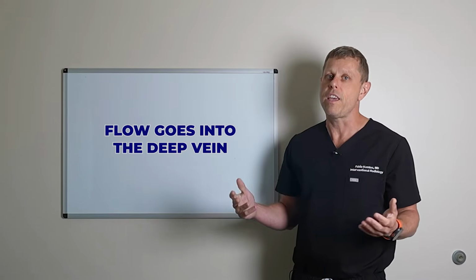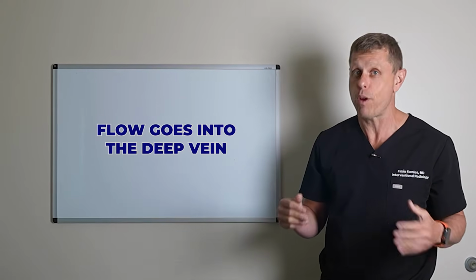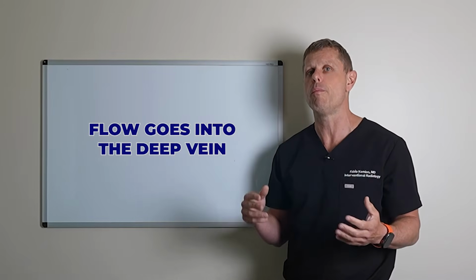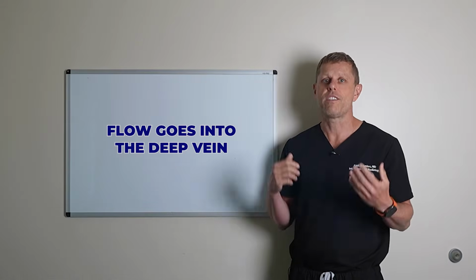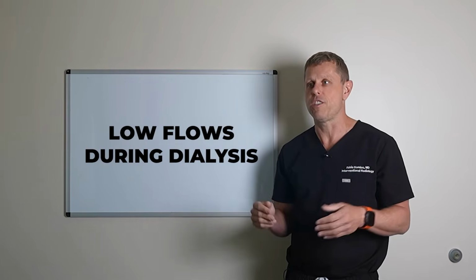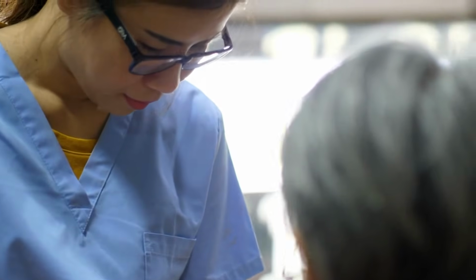So I would say if your dialysis fistula is not working after 3-4 months, you probably need a fistulogram to figure out what's going on, and most of the time we'll be able to do something to make it usable. Now, the second problem is low flows during dialysis. You may hear the nurse say, oh, the machine's beeping because we can't get enough flow.